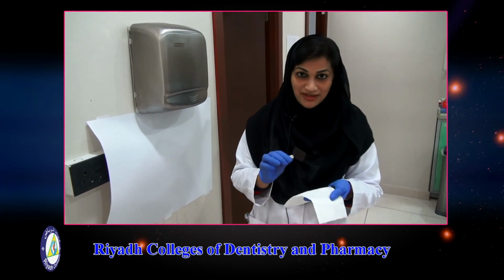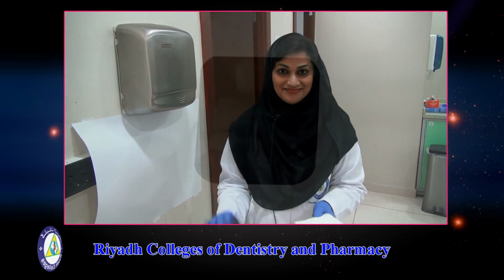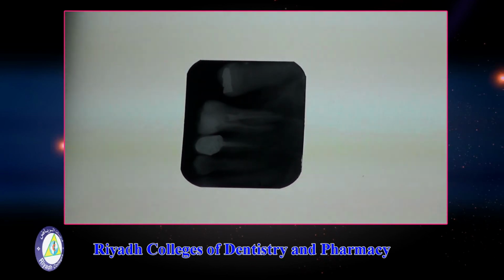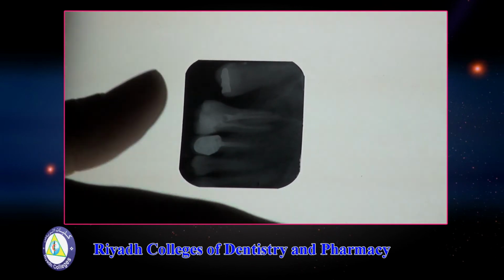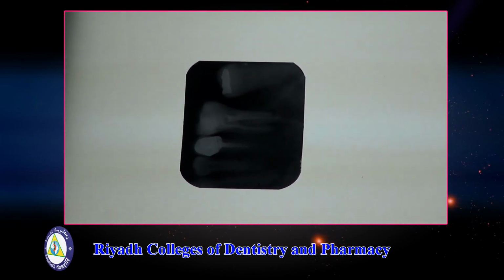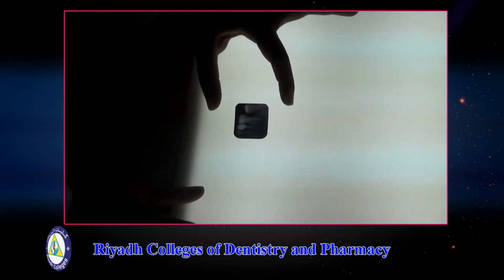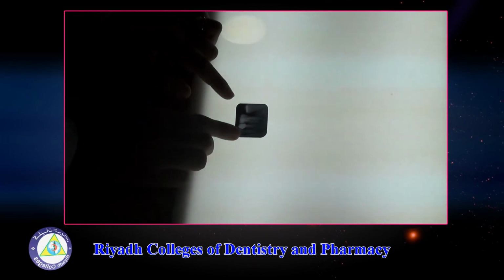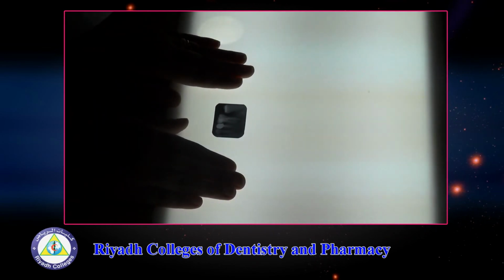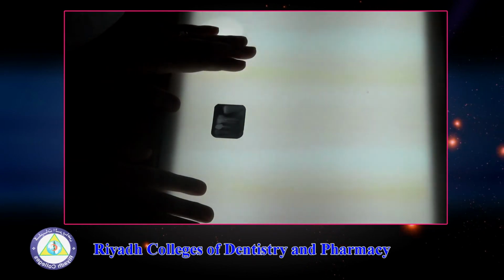Now the film has been dried. Now this is ready for viewing or interpreting. Once the X-ray has been dried, it is viewed with the help of a white colored view box. The specialty of this view box is that it will allow only transmitted light, which is the actual apt light, to view an X-ray film. So now that we can view the X-ray film, we can start with the interpretation and diagnosis of this X-ray film.